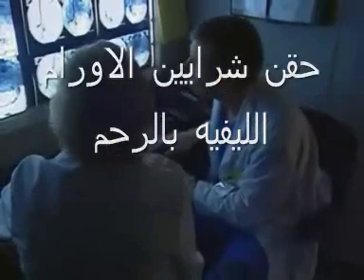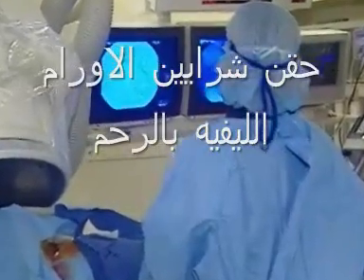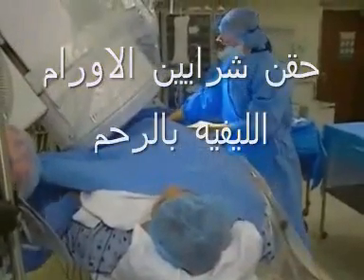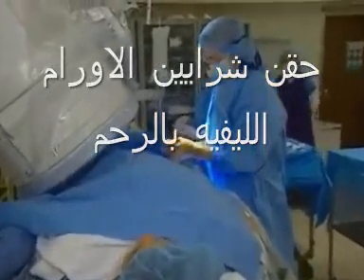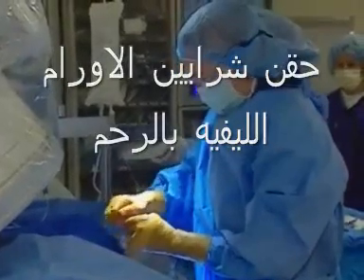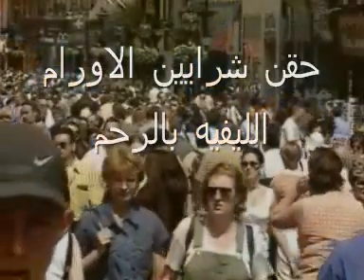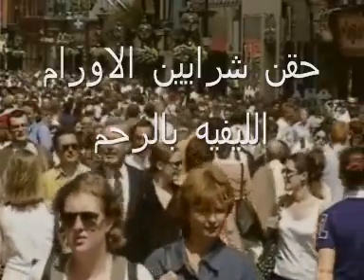Uterine fibroid embolization, or UFE, is a uterus-sparing, minimally invasive procedure used to treat symptomatic uterine fibroids. It is a catheter-based procedure performed by an interventional radiologist. During UFE, a catheter is guided into the uterine arteries. Tiny beads are then injected via the catheter into the blood vessels that feed the fibroids. Over time, the lack of nourishing blood causes the fibroids to shrink, resulting in a dramatic reduction of common fibroid symptoms. UFE is not recommended for women who are pregnant or who wish to get pregnant.